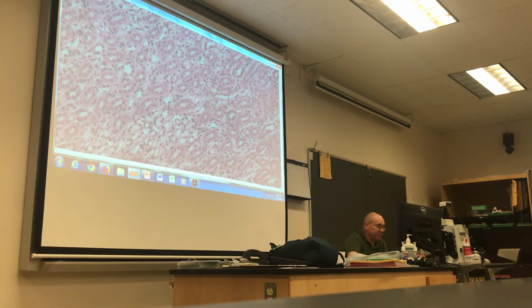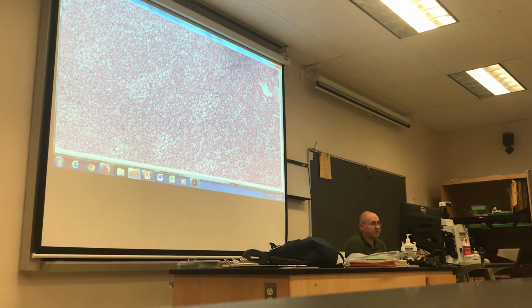You just know that they're tubules of the nephron, right? For the most part, you don't need to differentiate them, but when all you see is tubes, you're definitely in the medulla, right? So that's what you're dealing with when you look at the kidney. Are there any questions about the kidney? No? Or the minor calyx or major calyx? None of that on the kidney.